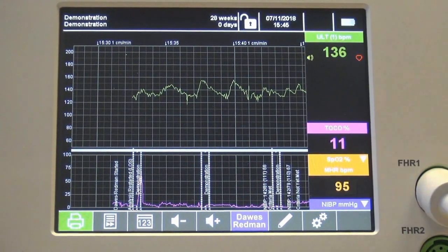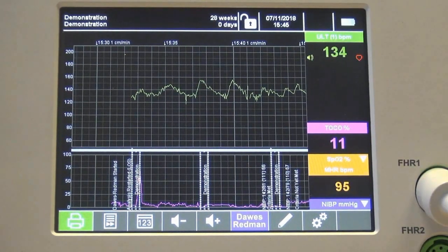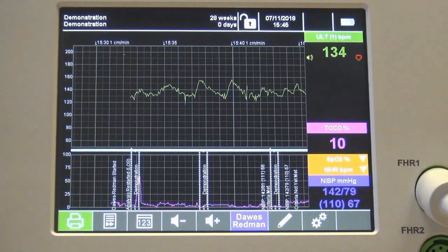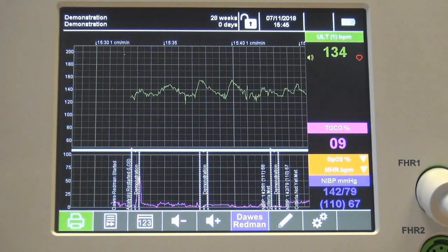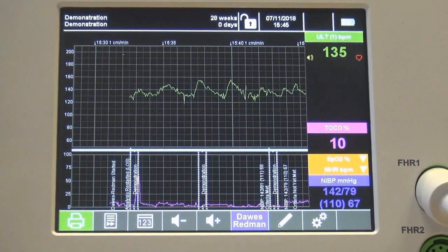Press the drop-downs to view the SPO2, maternal heart rate, and the latest blood pressure reading. Note that you cannot view the SPO2 and the maternal heart rate at the same time in trace view. Switch back to the numbers view for this.